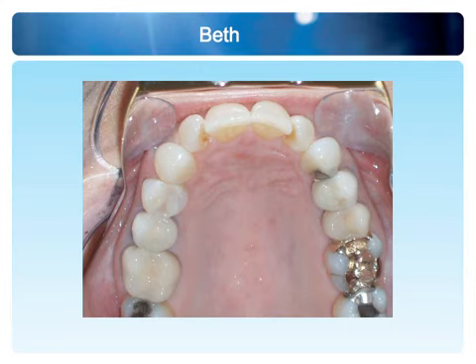Now, one thing we would like to consider here is, imagine those laterals having erupted perfectly straight. Now, what would have happened to the canine? Interesting thought, right? If the upper laterals erupted perfectly straight into position, the canine would have erupted distal buccal to its current position. And so, if I want to get that lateral to where it belongs, I would have to draw the canine distal buccal.